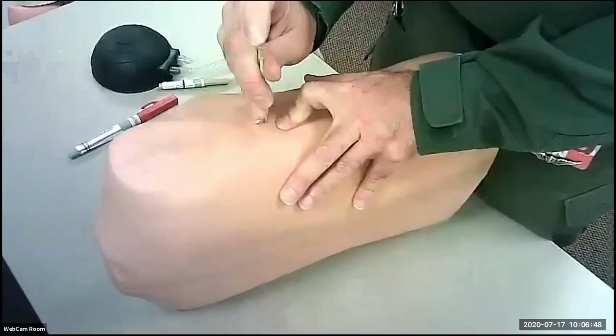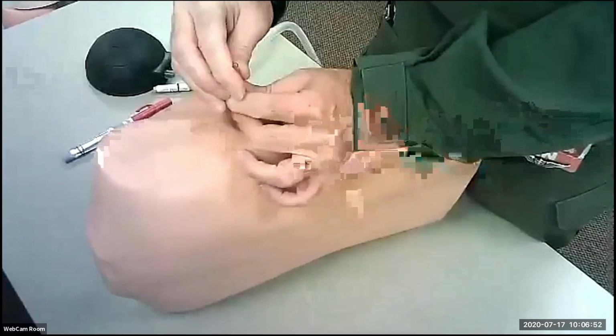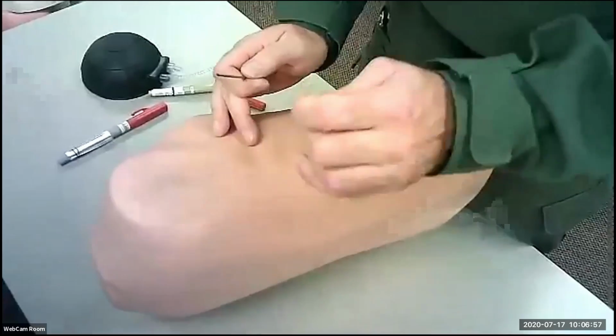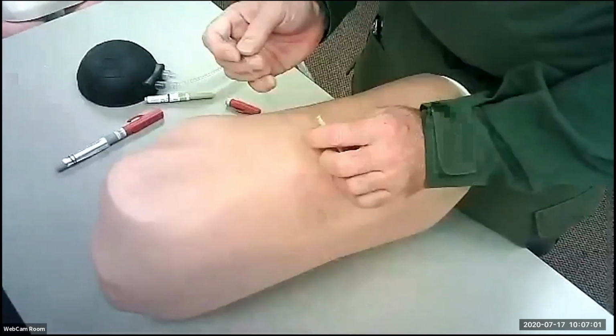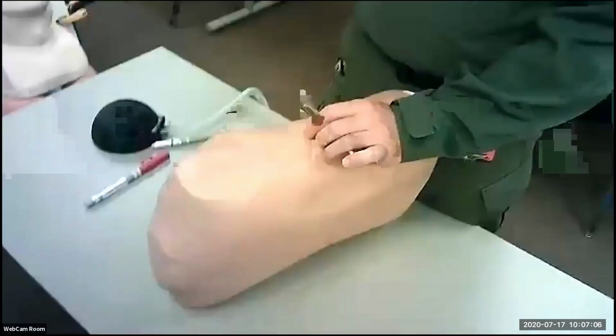So it's the same thing. You're going to go on a fifth rib, go up. This mannequin's not actually designed to do this. Up and in, pull it out. Okay, both of these work. This is where you're going to put the chest tube, this exact spot. Tag team wise, I'd probably rather you just do a finger thoracostomy. Either way, I'm getting a chest tube.